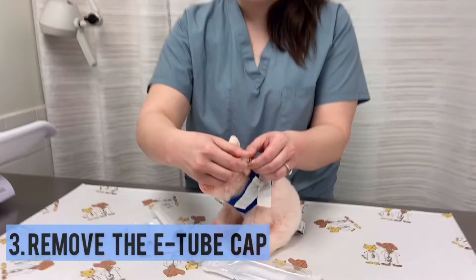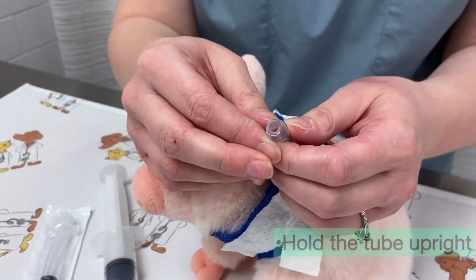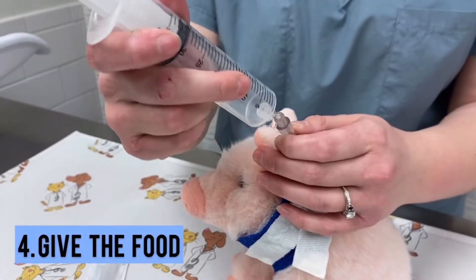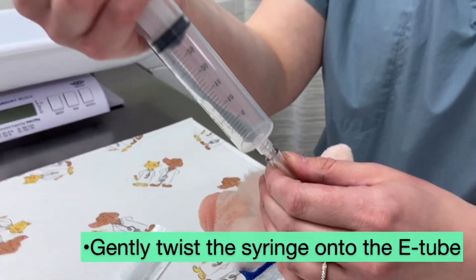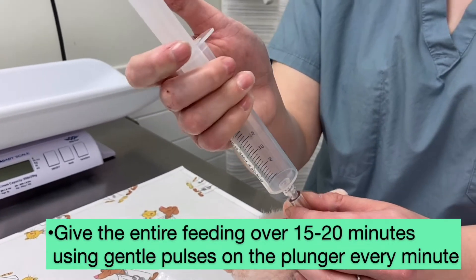Take the cap off the tube — it might have a little bit of water that might spill out, so keep it upright. You're going to have your food in your syringe and twist it onto what we call the Christmas tree. Then push slowly, about one push every minute or so, as long as your pet is tolerating that.